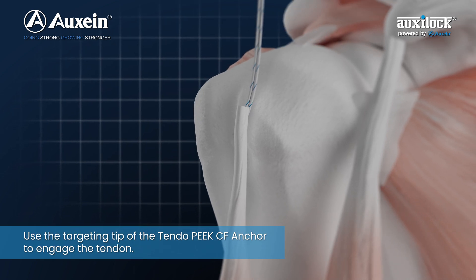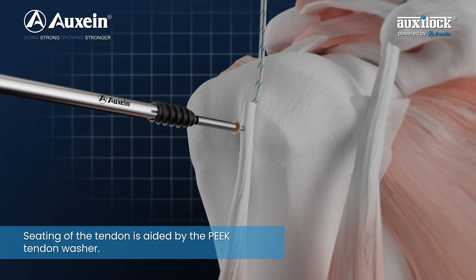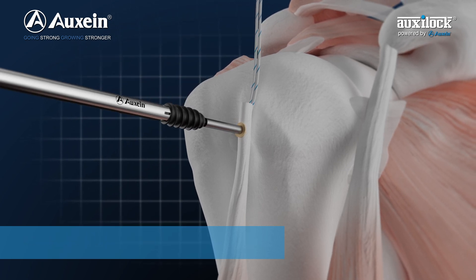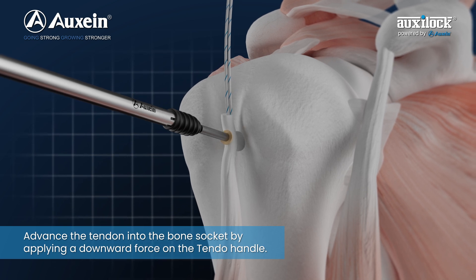Use the targeting tip of the Tendo Peak CF anchor to engage the tendon. Seating of the tendon is aided by the Peak Tendon Washer. Advance the tendon into the bone socket by applying a downward force on the Tendo handle.